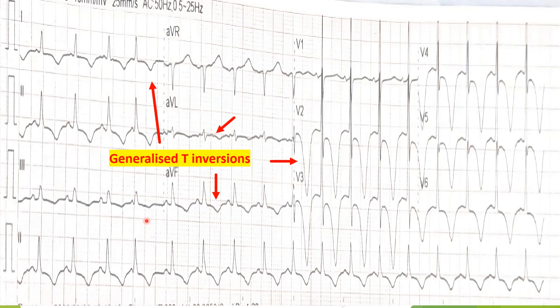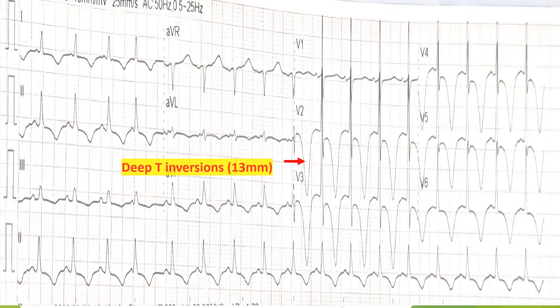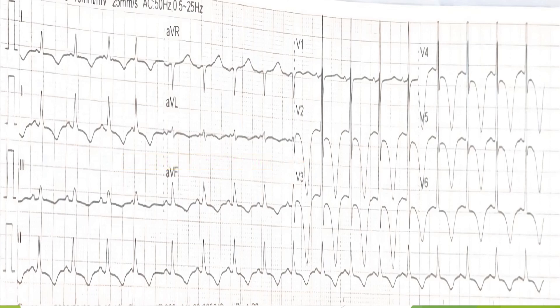So what can be the reason for that? Before proceeding further, let's find some other pathologies in this ECG. These T wave inversions are pretty deep — you can see they are 13 mm, which is not usually seen. Along with the inversions, we can see very obvious ST depressions, which are clearly visible in these leads.